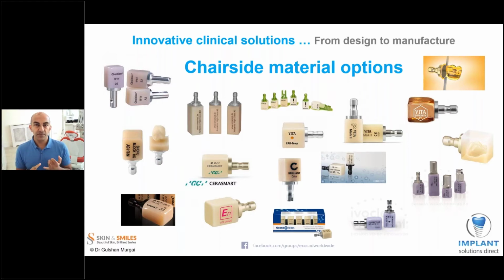There are a combination of lithium silicates, lithium disilicates, we have PMMA, we have feldspathics, a whole host of different restorations, including your very well-known brands there. And you will find that most of the big international brands are creating substrates of this type for chairside restorations, because it's becoming more and more popular worldwide, especially now that it's something which is open architecture.